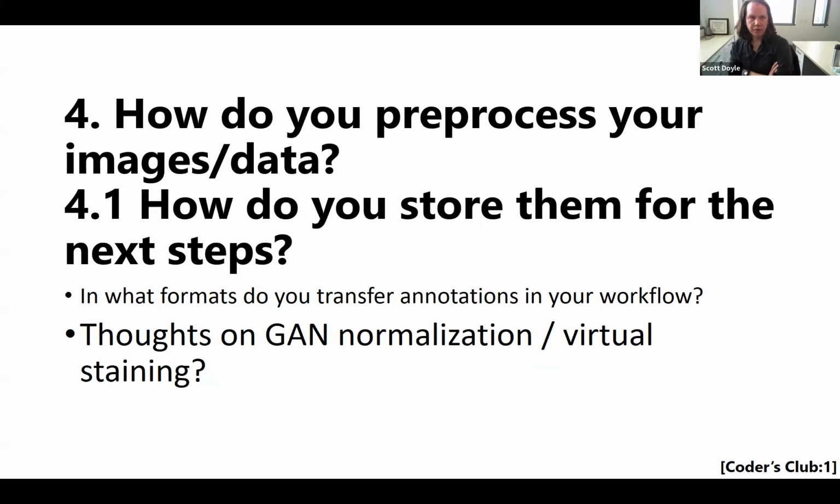Well, the real test is you have data from 3 different sites. You train on data from one site and test on the second. You train from data from 1 and 3 and test on the second. And then you train on data from 1 that's been GAN augmented to the same data set size as 1 + 3, and then test that on 2. And then you see what the difference in results are.